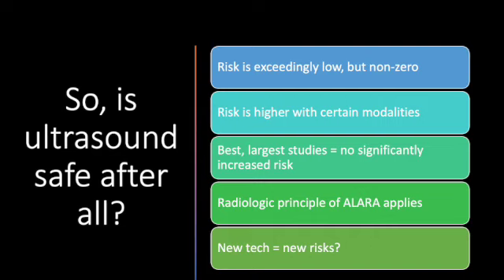And the fact that this technology is evolving does mean that there's new technology, new modalities, new settings that are coming out all the time in ultrasound. While that's exciting and it means that we're going to be able to do more and more things using point of care ultrasound technology in the future, it also means that we need to learn and be aware of the risks because they're probably also developing and growing in their own way. And so while we know ultrasound is safe, it is something that we need to continuously revisit as it grows and changes and technology continues to progress.